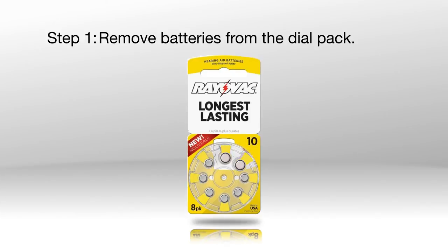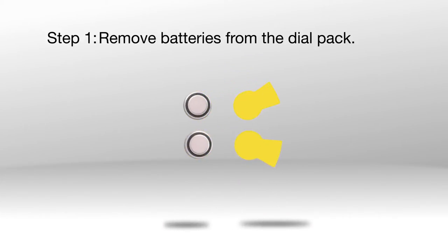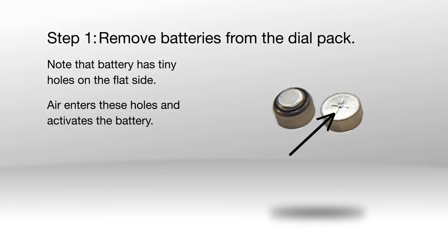Step 1: Remove the batteries from the dial pack. Remove the yellow sticker from each battery before inserting it. Note that the battery has tiny holes on the flat side — air enters these holes and activates the battery.